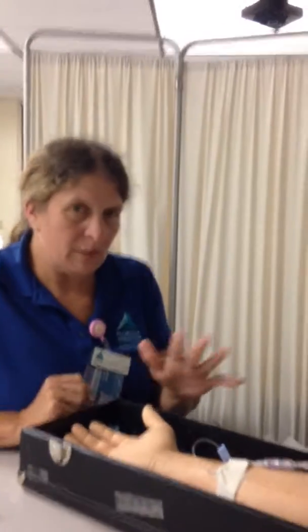I'm going to check that the IV's running good and that it's not infiltrating and the patient has no pain. I'm going to adjust the normal saline rate. That's the reason I put it at the rate I put it at. I'll tell them I'll be back in 15 minutes to check on them, and everything's running good. So I tell them I'll be back in 45 minutes when the IV is done.